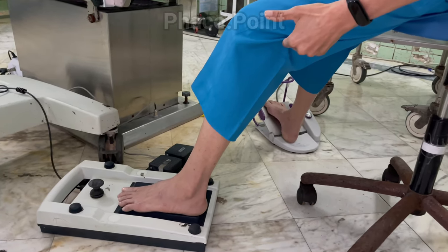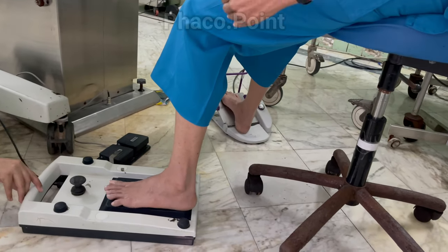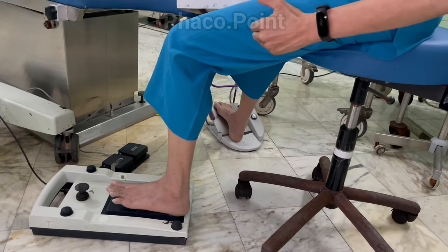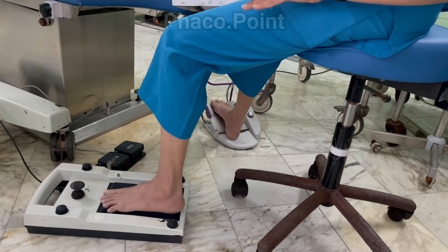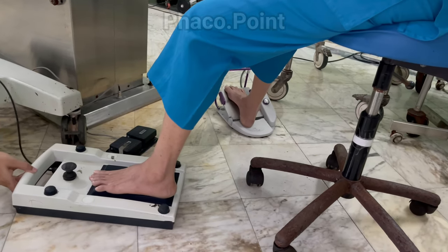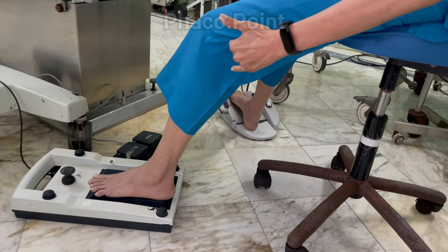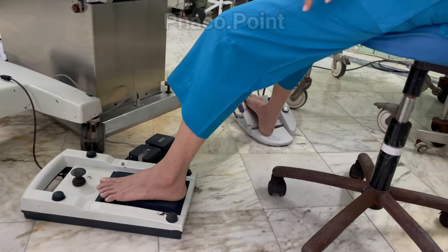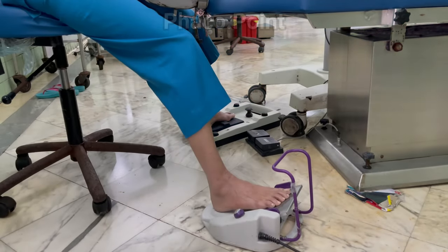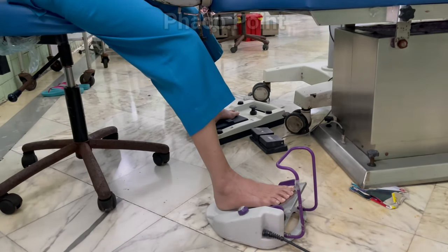An angle greater than 90 degrees allows for ease of dorsiflexion and plantarflexion of the foot. If the foot pedal is too close — giving an angle less than 90 degrees — it makes these movements more difficult. I prefer to keep the foot pedals slightly further away to give a slightly obtuse angle, which allows me to very easily negotiate the microscope foot pedal. A similar angle should be maintained for the foot on the phaco pedal as well.